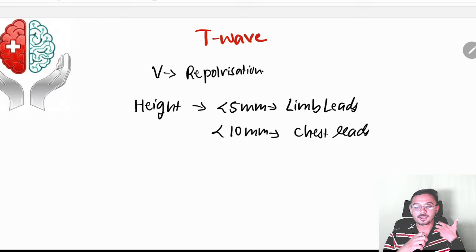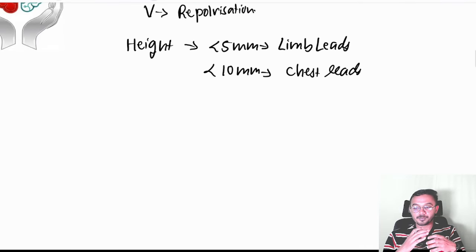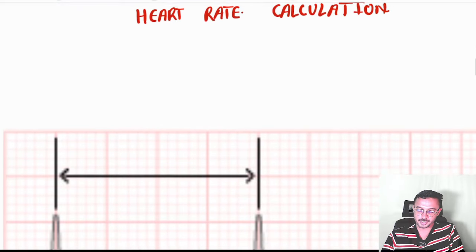So these are all about P wave, PR interval, QRS, ST segment and everything like QT and T segment, right? So these are all about the P, Q, R, S, T waves, and I taught you how they are generated. Okay, and now let's move to one of the ECGs.